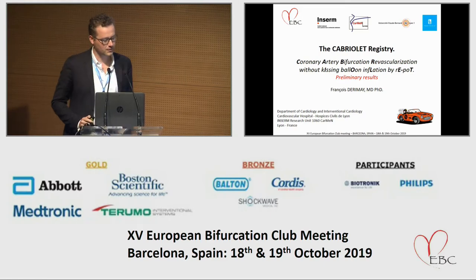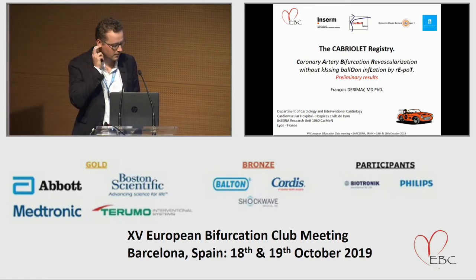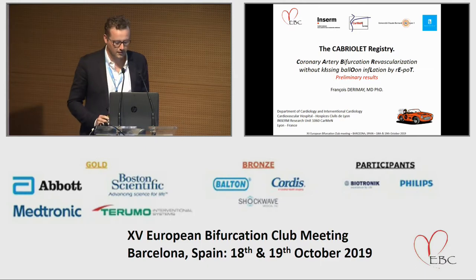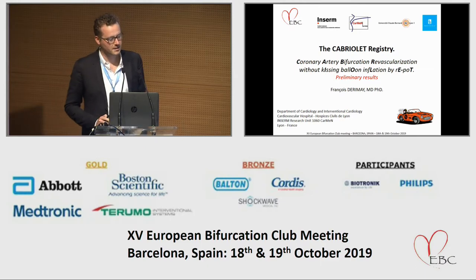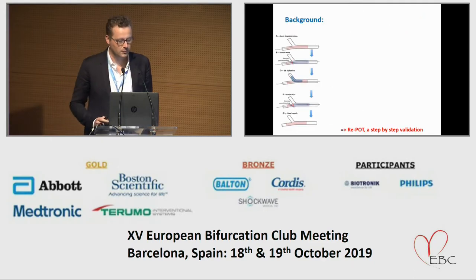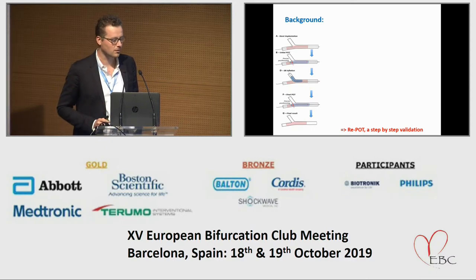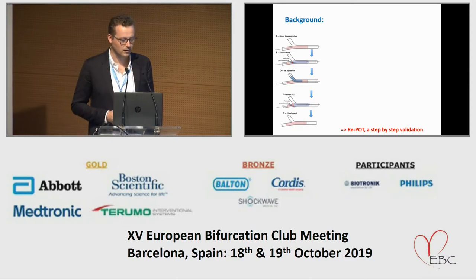Ladies and gentlemen, thank you for the invitation to present the preliminary results of the CABRIOLET Registry. CABRIOLET is a registry dedicated to evaluate the clinical benefits or not of the Re-POT. As you know, Re-POT is a pure sequential technique in three steps. Firstly, an initial POT, then a side branch inflation alone, and to conclude, a final POT.